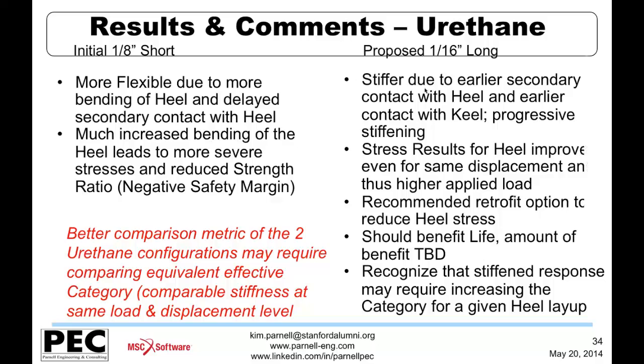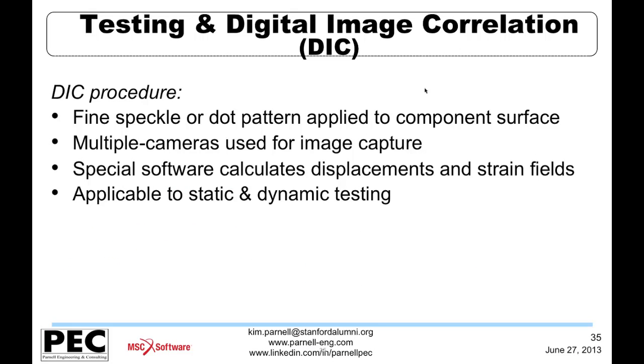And I want to talk a little bit about some testing we also did on these heel components using a process called digital image correlation, or DIC. This is an optical methodology. It makes use of multiple cameras and basically uses sophisticated software to take the camera images and compute displacement fields, and then from displacement fields compute strain fields, so 2D strain fields on the visible surfaces of the components.